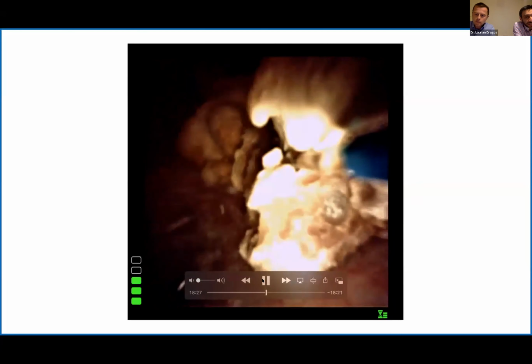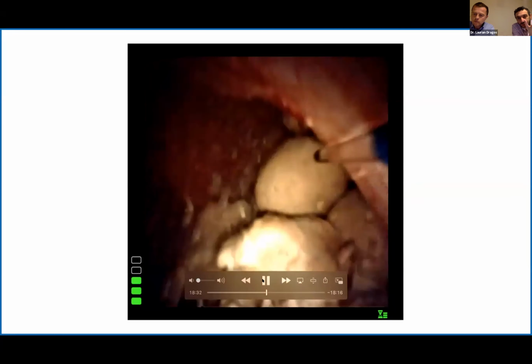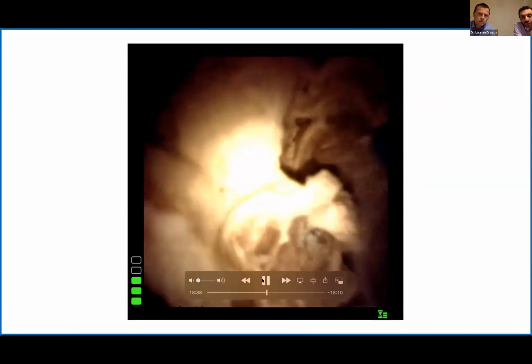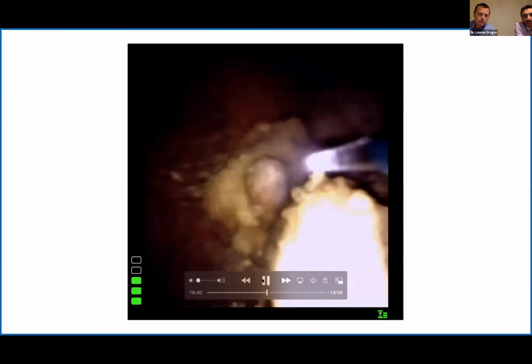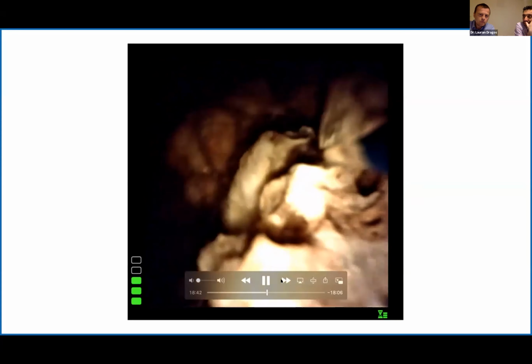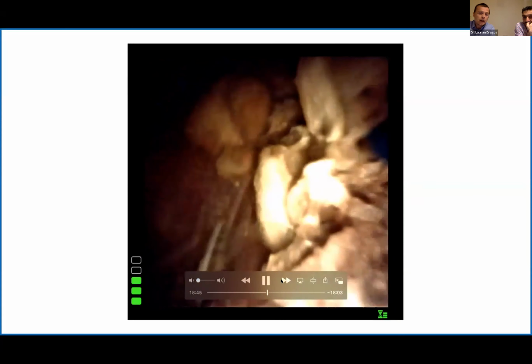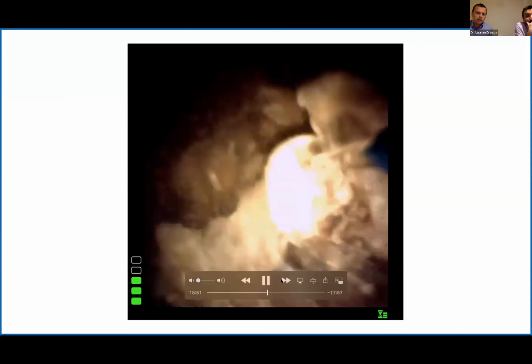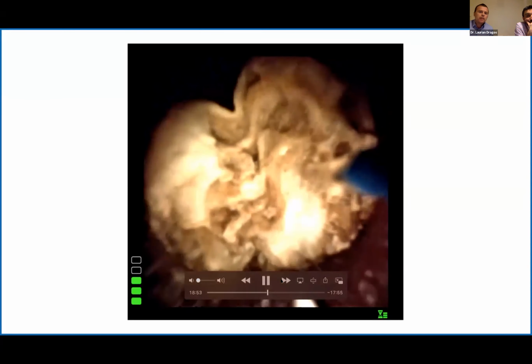It's interesting to say that this was the first time either of us had used this particular type of laser, the 35 watt laser. And with lasers, it does take time to get used to. I may increase the frequency to 50 hertz and have 0.2 or 0.3. So it's important to get to know your laser, to see what it can do and how to play around with the settings. Yeah, definitely. It was the first time for me as well when I used it. It's a 35 watts laser.